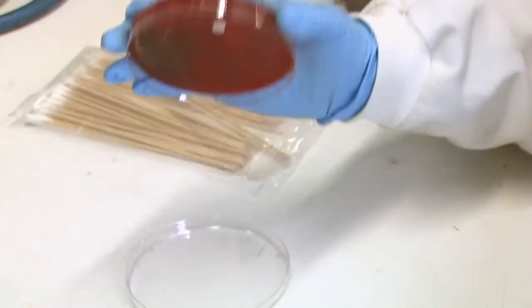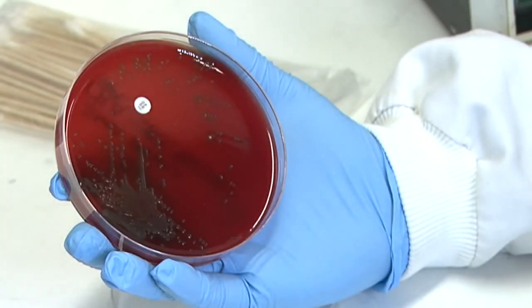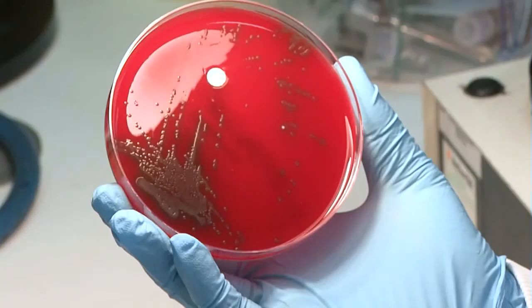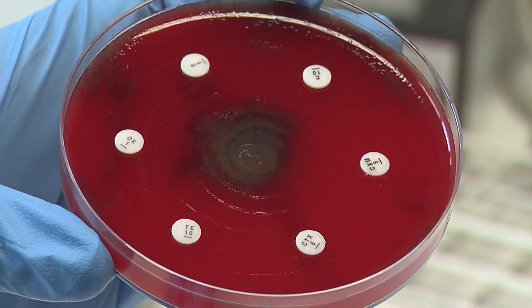The aim for the scientists working on the blood culture bench is to have a culture result, a presumptive identification of the pathogen, and an antibiotic susceptibility result within 24 hours of the bottle becoming positive on the machine. As indicated, this patient's blood culture grew a Streptococcus pneumoniae. This plate shows alpha hemolytic colonies on blood agar that are sensitive to optochin, and the sensitivity plate shows the isolate to be fully sensitive to the antibiotics tested.